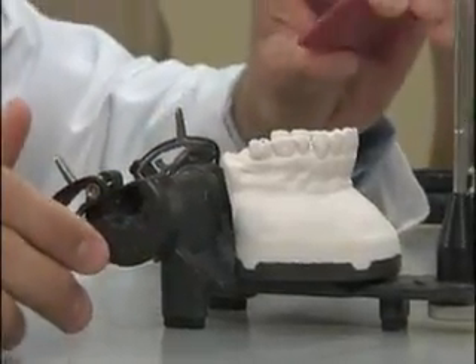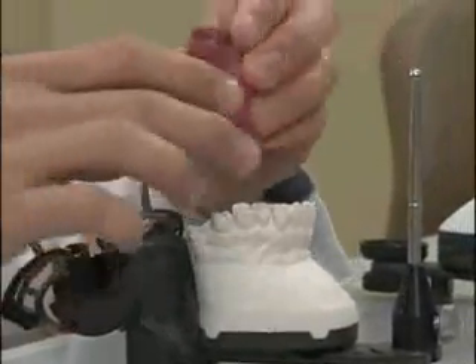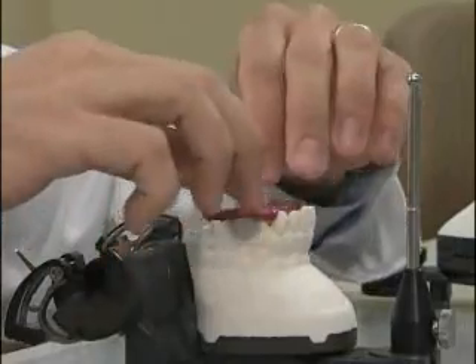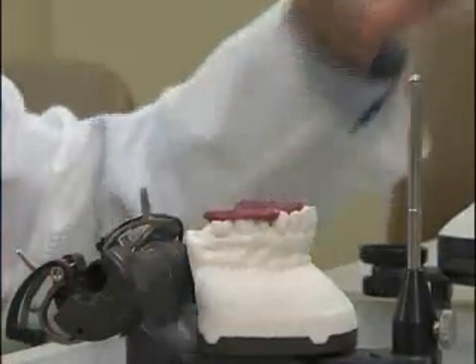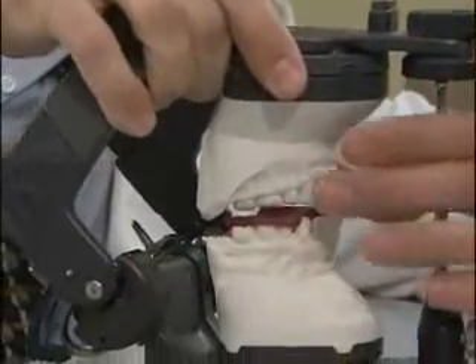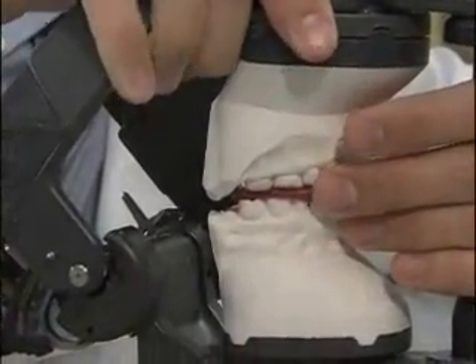Place your protrusive record on the upper arch, making sure that it seats firmly. Next, take the lower member of the articulator, invert it, and fit it together with the upper member into the protrusive record.